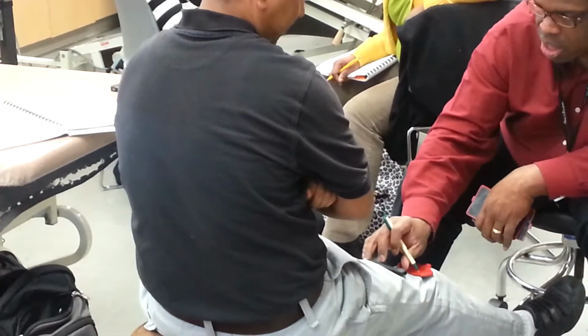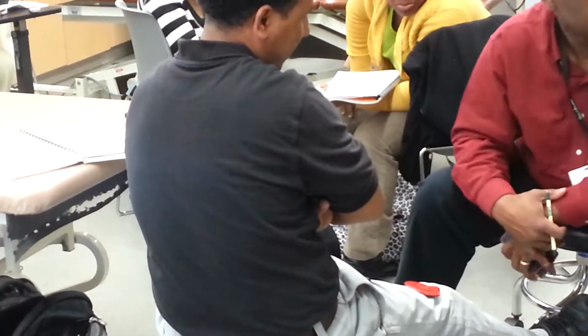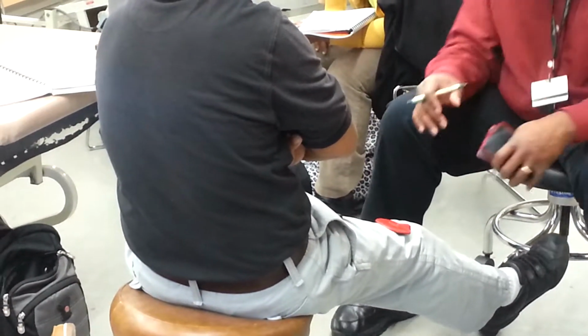Now, if I do this, I'm going to get burning. Okay? Now, what muscle, if I do this, will I reach? Into the superficial, into what is it called? Exactly, the intermediate. What's the name of the muscle? Rectus femoris. The underneath one. I'll give you the points if you can give me the name. Vastus intermedius. Good.